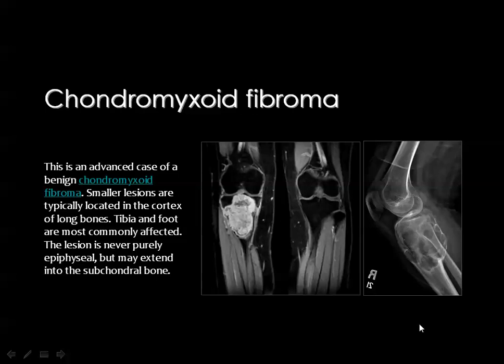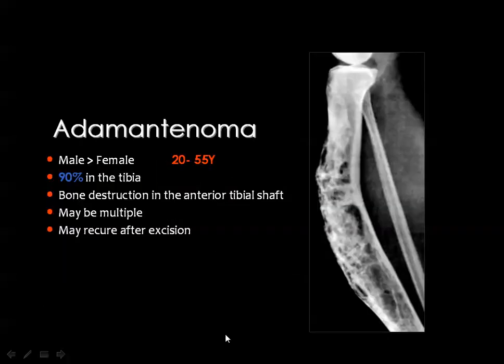You have the right to diagnose this as giant cell tumor, but this tumor has been proved histologically to represent a chondromyxoid fibroma. Then you know that there is some overlap, and this tumor is classified in the last group because in many cases you cannot predict its nature unless you biopsy this lesion.